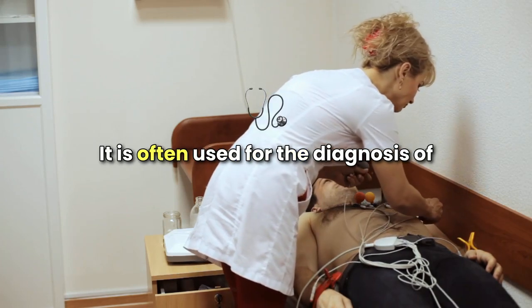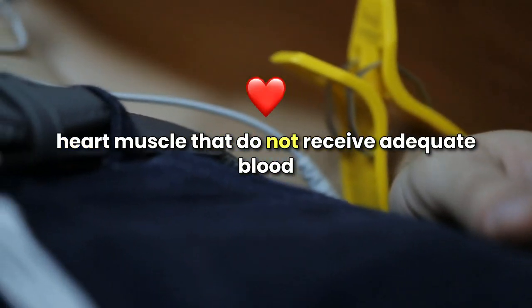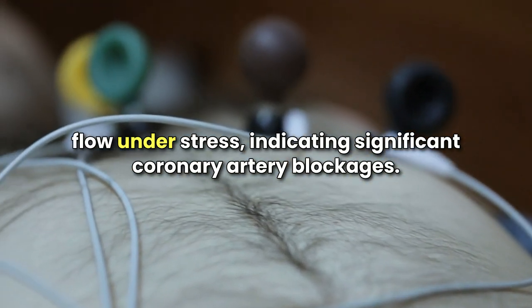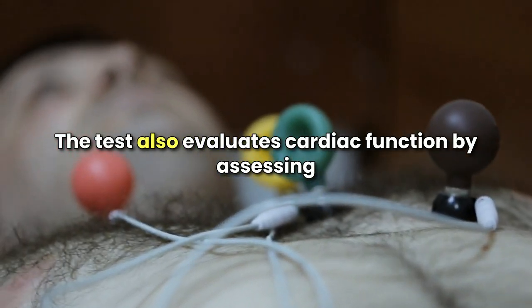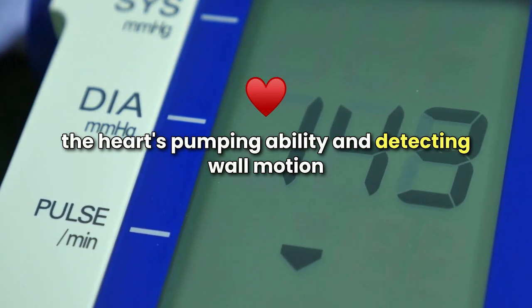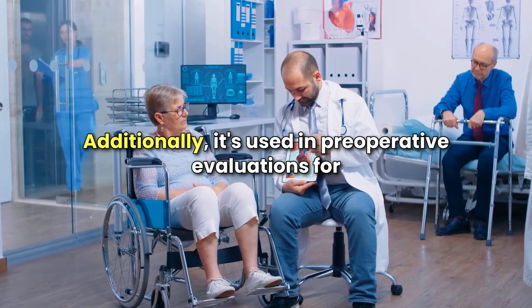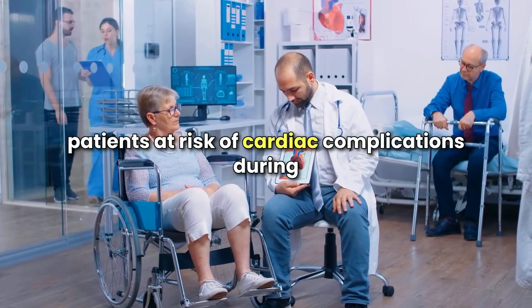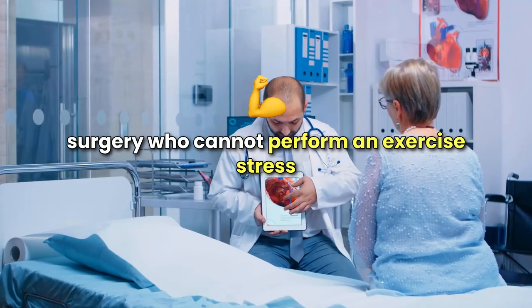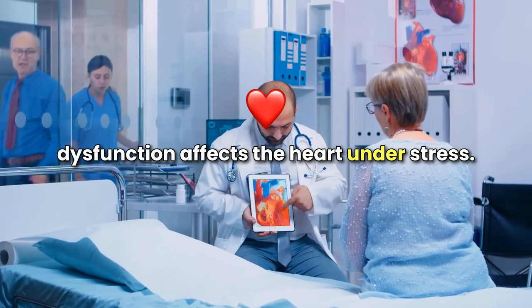It is often used for the diagnosis of coronary artery disease to identify areas of the heart muscle that do not receive adequate blood flow under stress, indicating significant coronary artery blockages. The test also evaluates cardiac function by assessing the heart's pumping ability and detecting wall motion abnormalities that may not be apparent at rest. Additionally, it's used in preoperative evaluations for patients at risk of cardiac complications during surgery who cannot perform an exercise stress test, and for assessing how heart valve dysfunction affects the heart under stress.